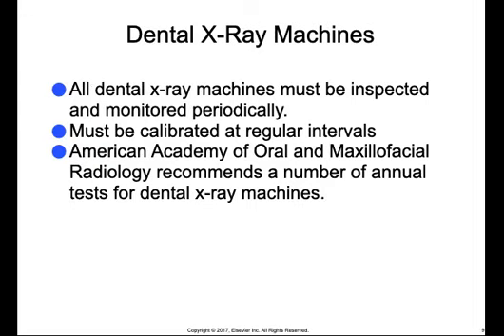Local and state regulatory agencies provide the inspection services, but it's the ones that use the x-ray equipment, such as the hygienists, dental assistants, and some manufacturer service representatives, that can actually perform the annual tests.